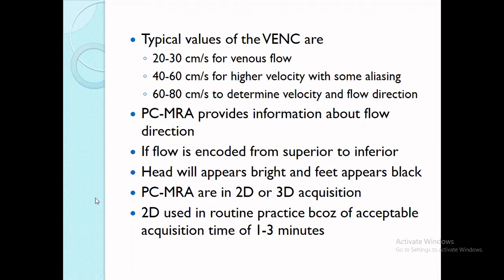PCMRA can be acquired in two-dimensional as well as in three-dimensional. Two-dimensional is used in routine practice because of the acceptable acquisition time of 1 to 3 minutes. As we know, when we go toward higher technology, it needs a lot of time as well as technological demand.